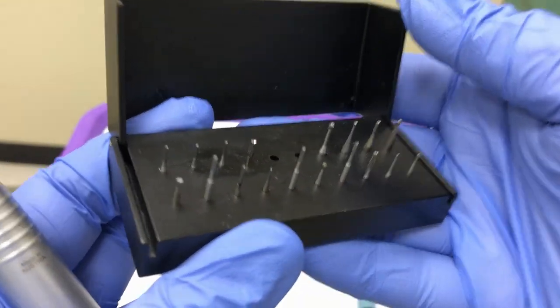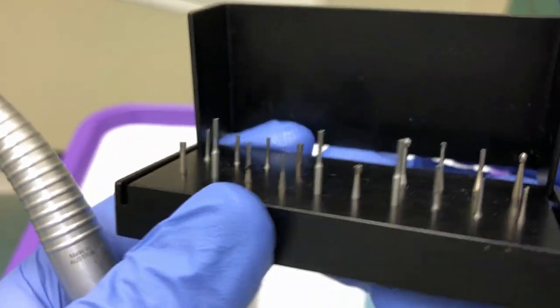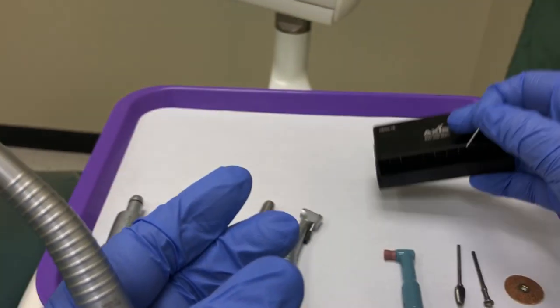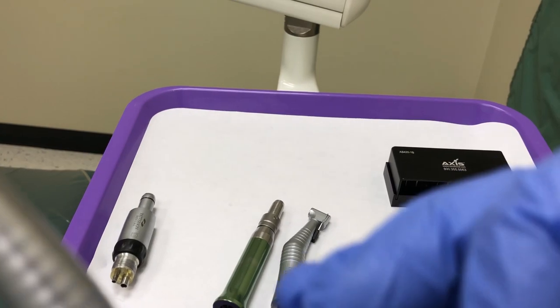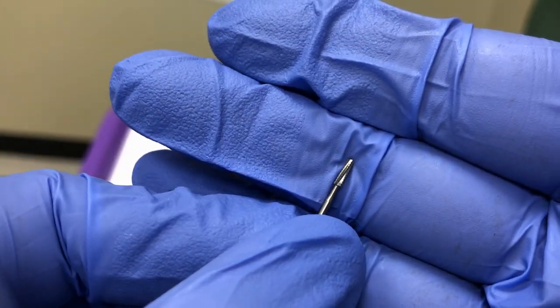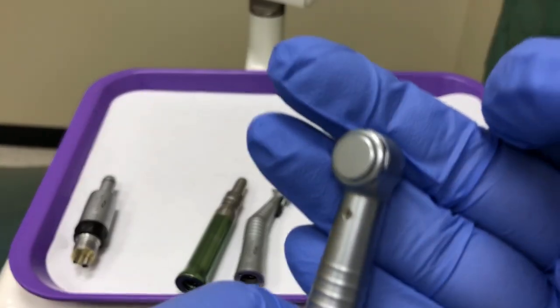For this example, we're going to select a 702 burr, which is a tapered fissure crosscut burr. An up-close look at the burr shows that the tip is tapered and the flutes have notches in them, which are your crosscuts.